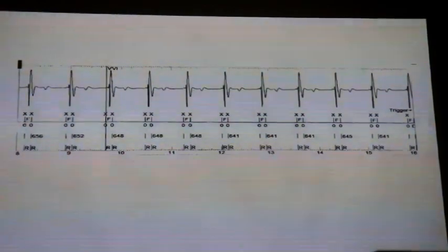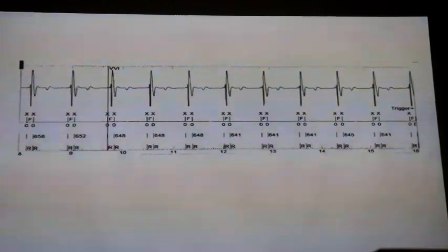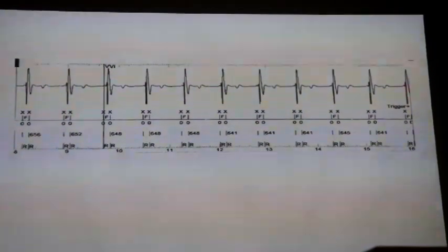New morphology, none of that anymore. It does it over 8 beats. It does it over a wider range. It's a much more average signal, and it's a wider signal as well. So old morphology was tip and ring. The new morphology is coil to can.